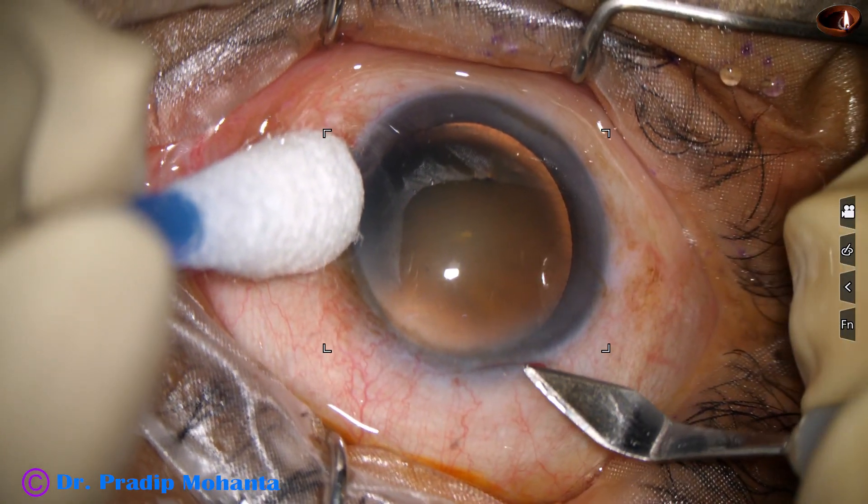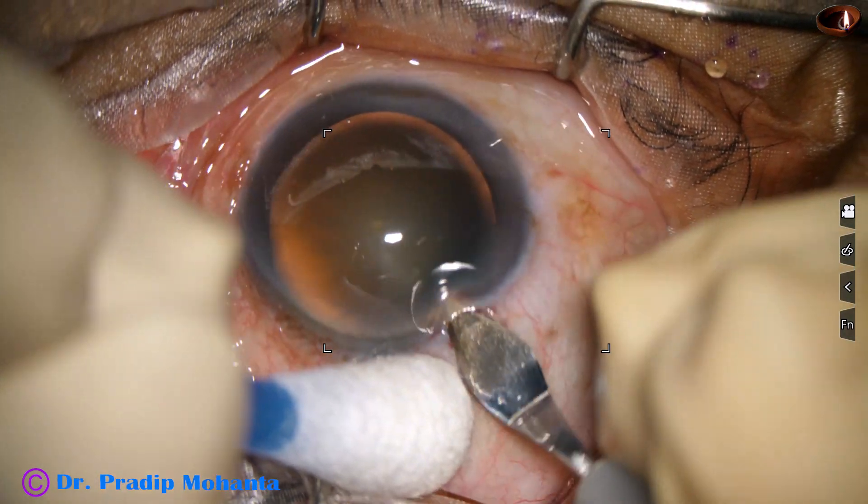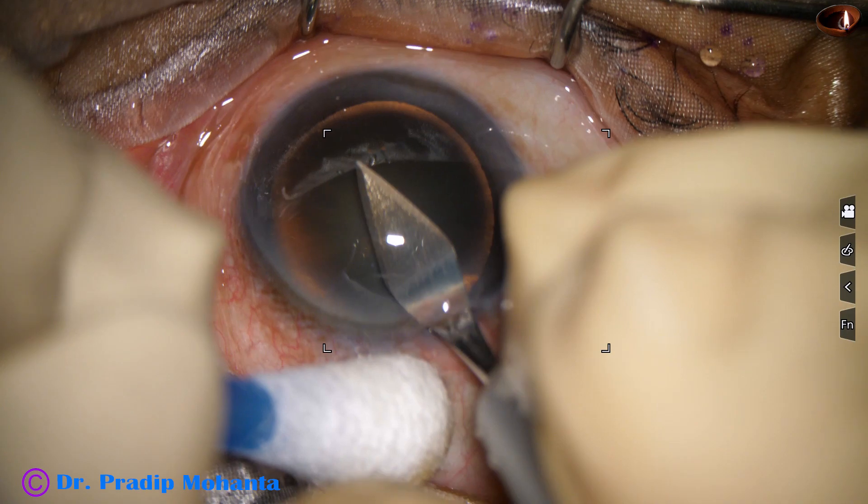And now the main incision — this is a triplanar incision, made with a 2.8 mm steel keratome.